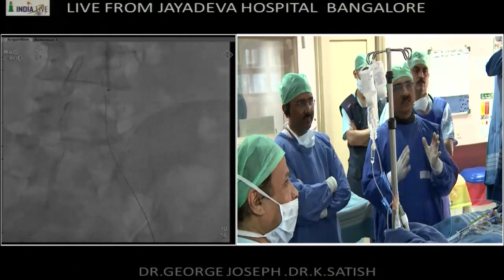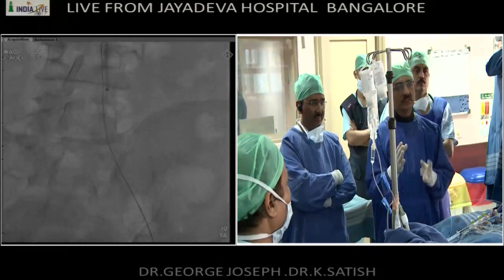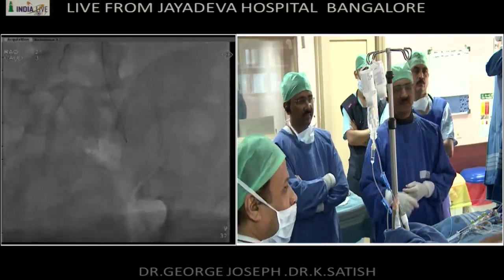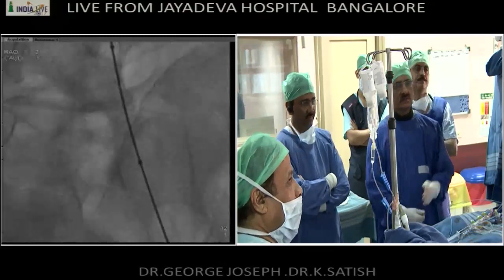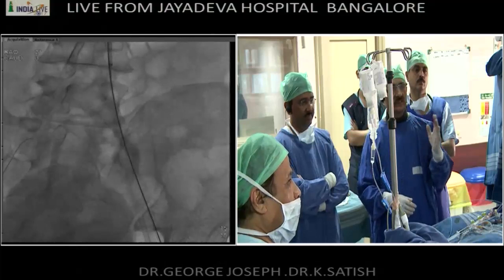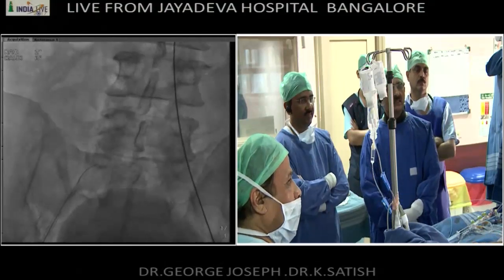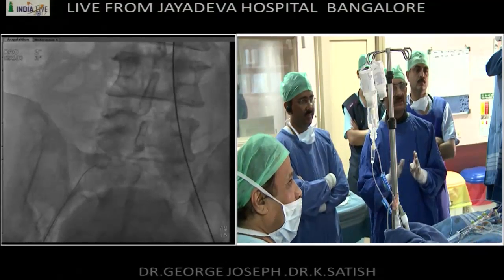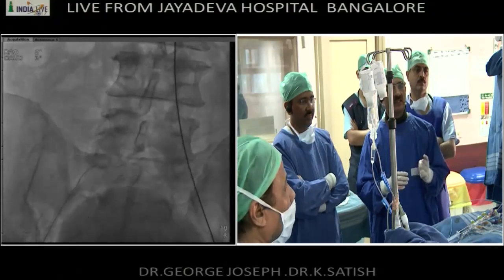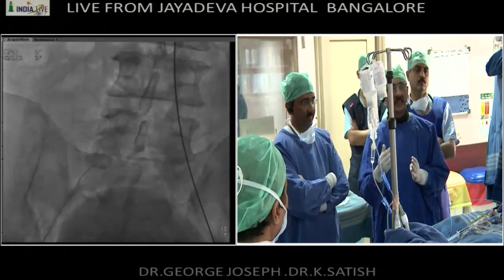So I don't want to raise a flap in the terminal aorta. Once I reach the proximal cap of the right common iliac occlusion, if the wire is tending to go subintimal, I will not persist with the retrograde. I will then start antegrade.